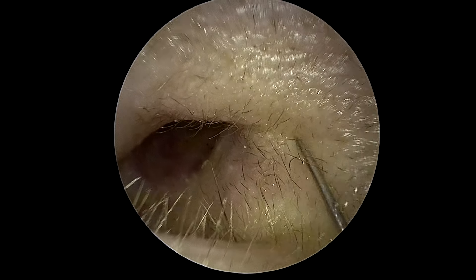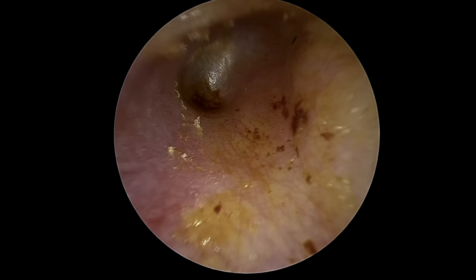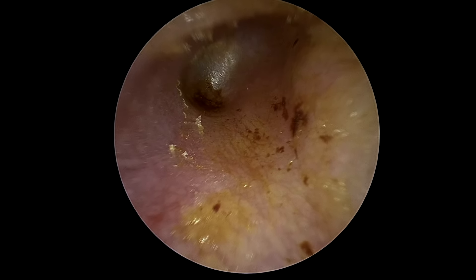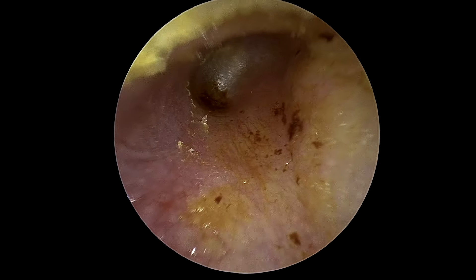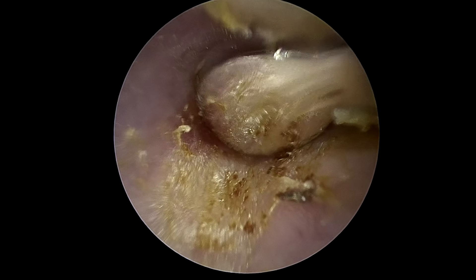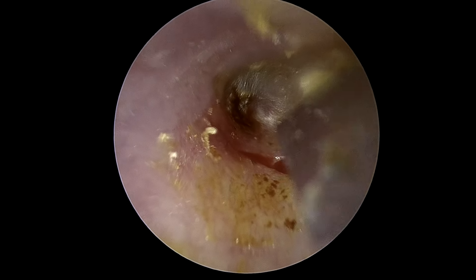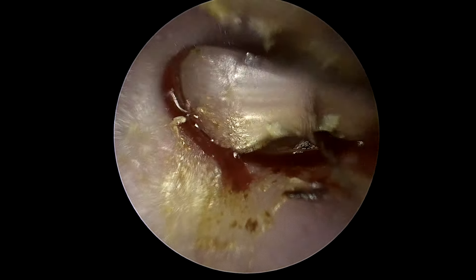We start by injecting 1% lidocaine with 1-to-100,000 epinephrine slowly over approximately one minute. Using an angled beaver blade, we then make a circumferential cut as outlined in the first slide.